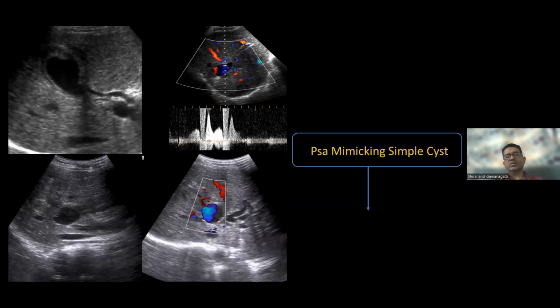In such cases, it should be further evaluated with a CT angiography. It will give you the vascular map and also save your time if you are going for an intervention, as to which artery has to be tackled. You can go after the Doppler also, but it's better to get a CT angiogram.